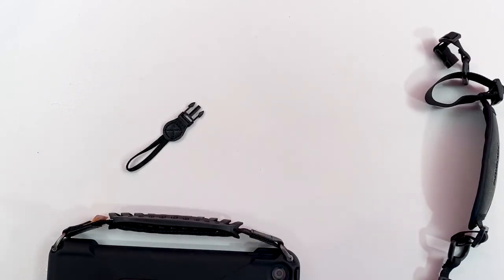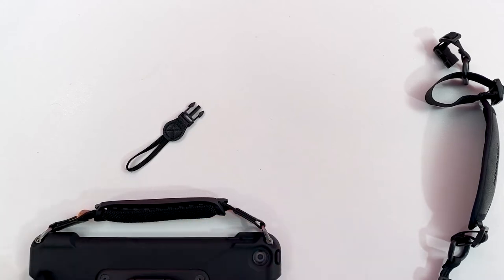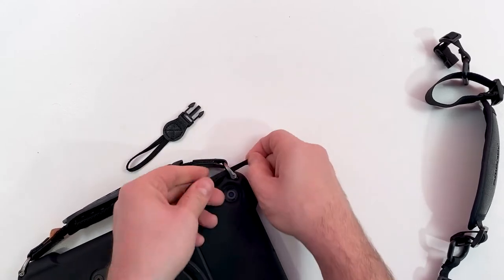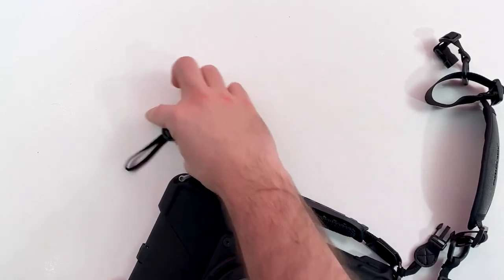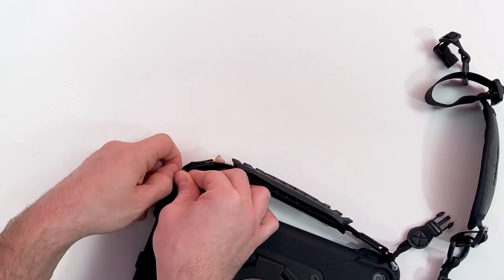Feed the loop end through the opening in the Quick Talker Freestyle case. Place the quick release clip through the nylon loop. Pull the quick release clip until the loop end is snug to the case. Then repeat this process for the other side.